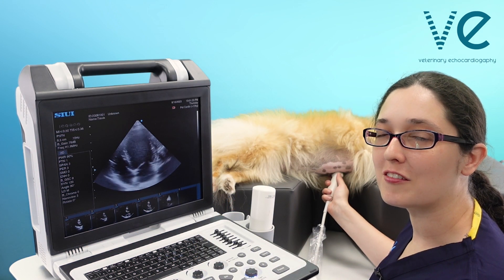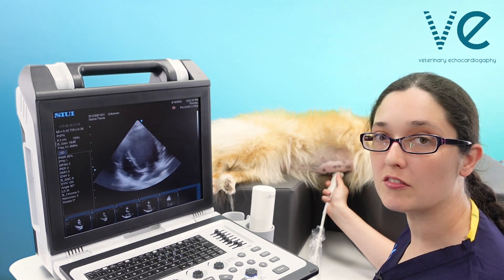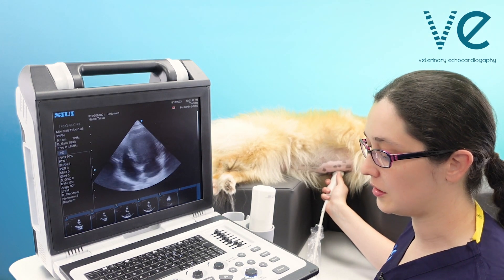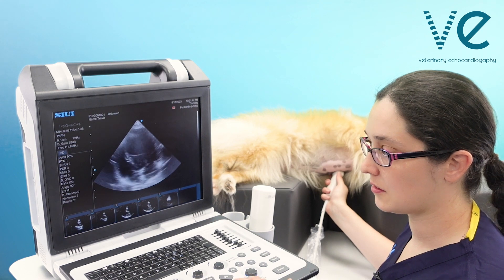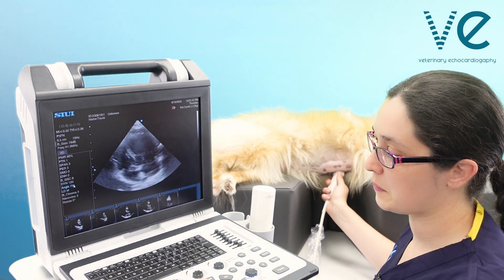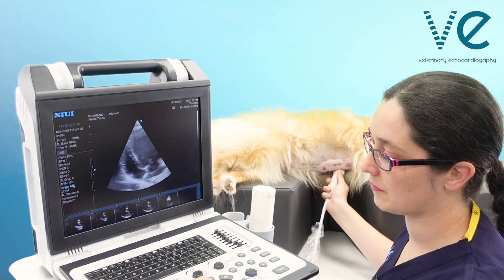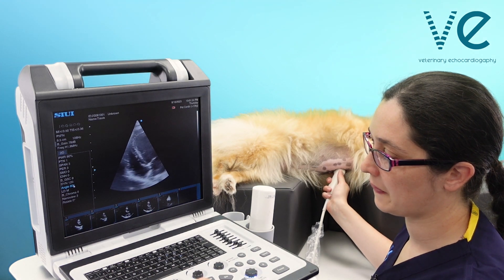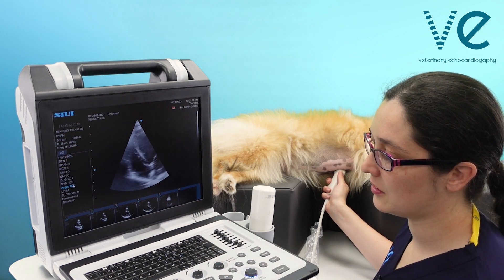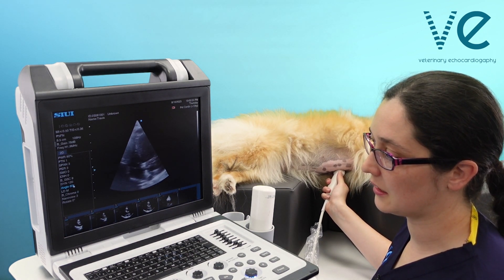First of all I'm going to get an RV focused view by tilting my hand to swing the right ventricle into the center of my image, making sure all of the right ventricle is in view. I'm going to narrow my sector width, and although the apex of the left ventricle remains central, all of the right ventricle is shown in my sector.